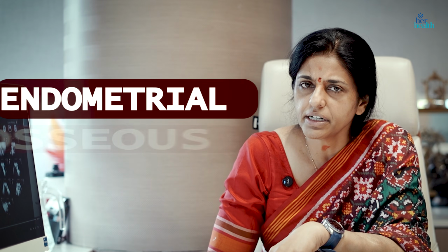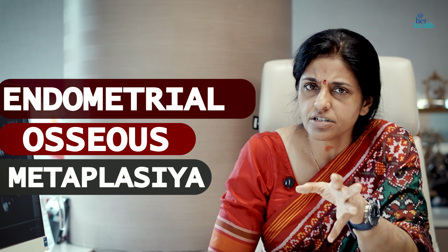In this video, I will show you what retained fetal bones or endometrial osseous metaplasia looks like on ultrasound. I will show you what it looks like on hysteroscopy. I will also show you the procedure of removal of these fetal bones and tell you some tips and tricks which I have learned over the years. And in the end, I will show you the histopathology of the tissue that we found. So let's go on this interesting journey when the uterus becomes a graveyard.